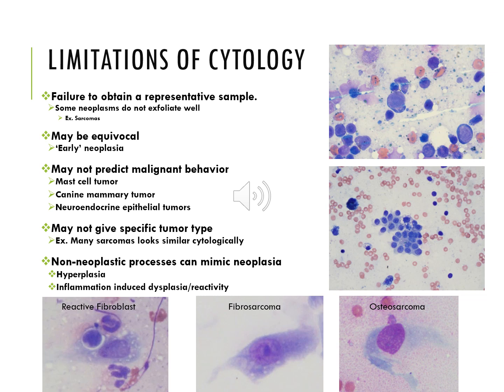One example of this was when I was on service with Dr. Weil, and we got a sample of a spleen, and it was just really ugly spindle cells throughout the whole aspirate. We were ready to call it some kind of sarcoma, like a splenic stromal cell sarcoma or something like that. It just looked terrible.